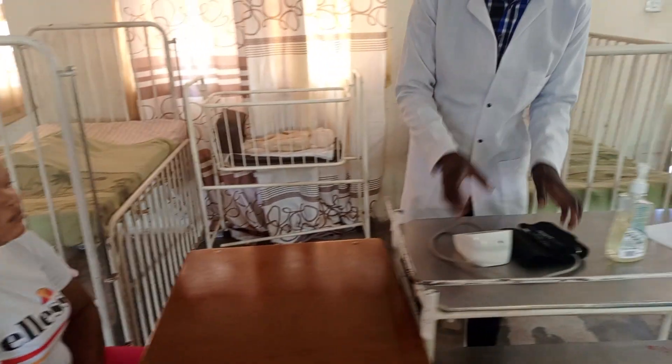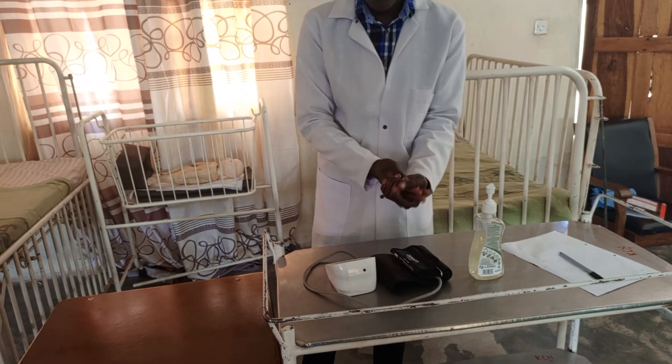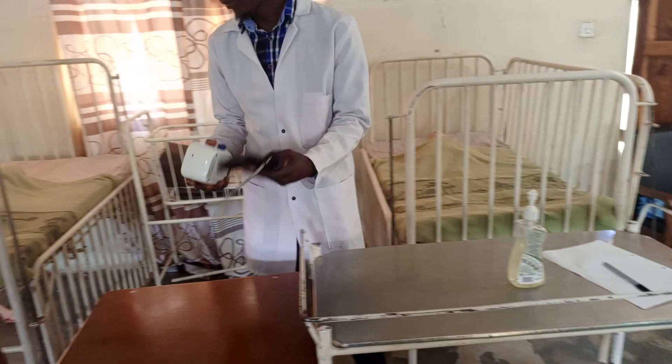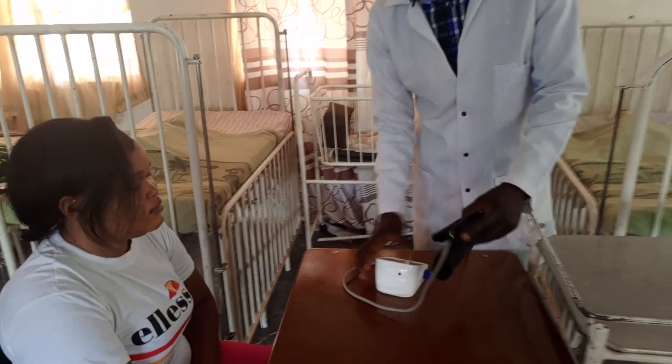So let's get started. Good morning, good afternoon madam. Good afternoon. So I'm going to check the blood pressure.